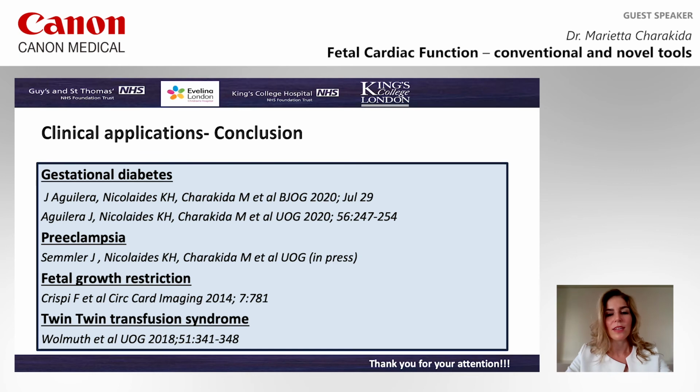To conclude, I would like to finalize my talk by saying that by using these techniques, our group and others have been able to detect early fetal cardiac functional changes in a variety of conditions, including gestational diabetes, preeclampsia, fetal growth restriction, and twin-twin transfusion syndrome.